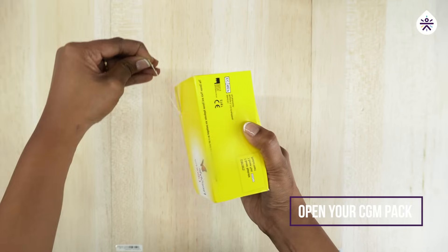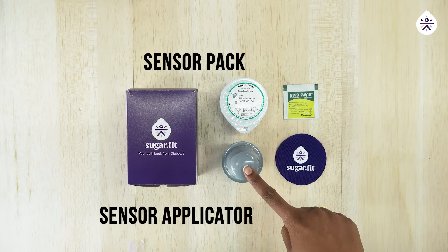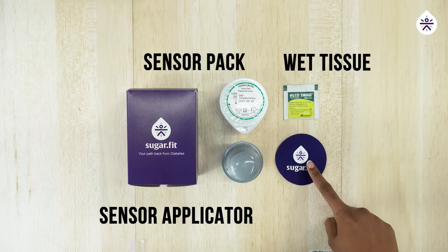Open your CGM pack. Your pack contains four items: sensor pack, sensor applicator, wet tissue, and a patch.